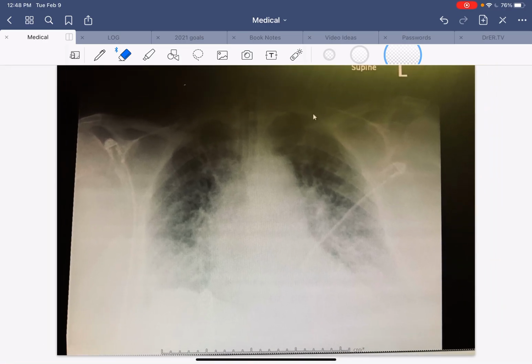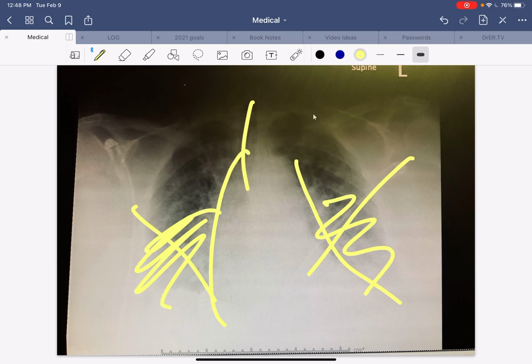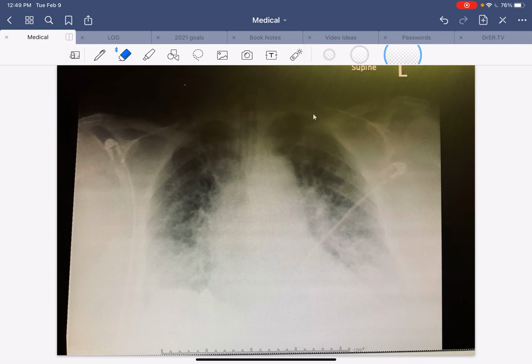And again, going back to how to read a chest radiograph, the initial overall approach: very abnormal x-ray, has things that shouldn't be there, like lines, an endotracheal tube, an enlarged heart, all this fluffiness over here. But then you go to the systematic approach. Remember, we talked about the penetration. You cannot see the vertebral bodies behind, so this is not a very well penetrated x-ray. And that's just a side effect of the patient being so obese. You can't get a good penetration.